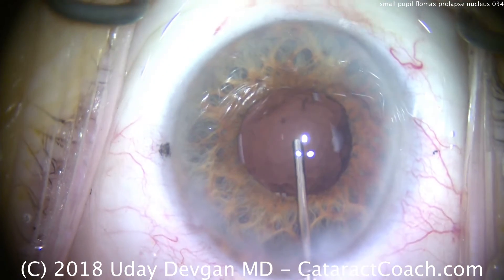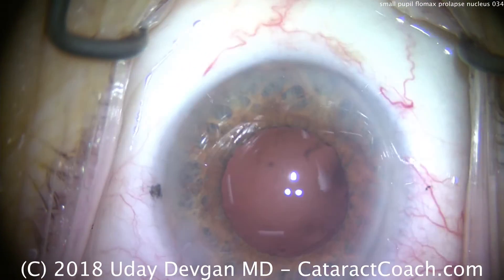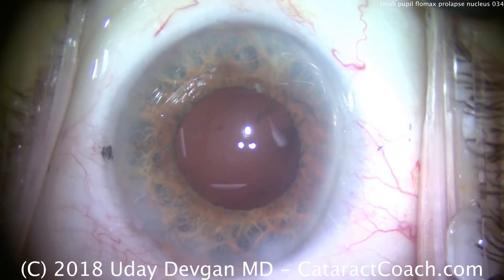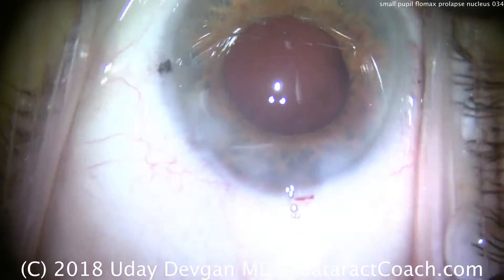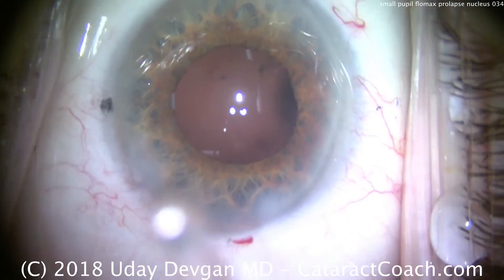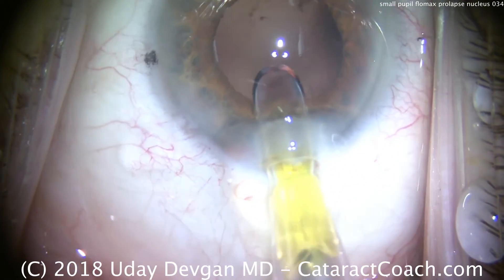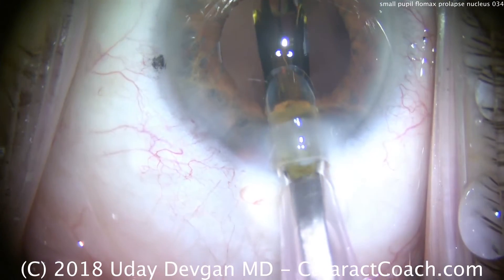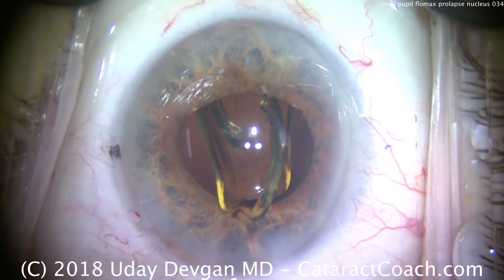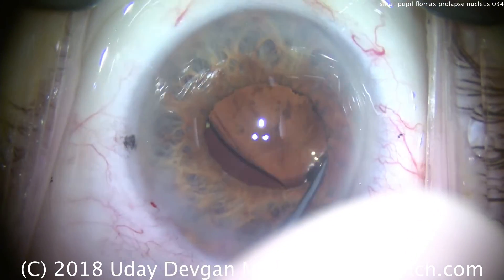We fill the eye with our cohesive viscoelastic, which is going to expand the pupil and deepen the capsular bag. And here comes our IOL. The IOL in this case is going to be a toric lens — a single-piece acrylic lens. Now you're wondering why the patient is moving so much: this patient got nothing in the IV. This is only topical intracameral lidocaine — no IV sedation whatsoever due to health issues. There's the IOL going into the capsular bag. The leading haptic went in; let's get the trailing haptic in — nice and deep in the bag.